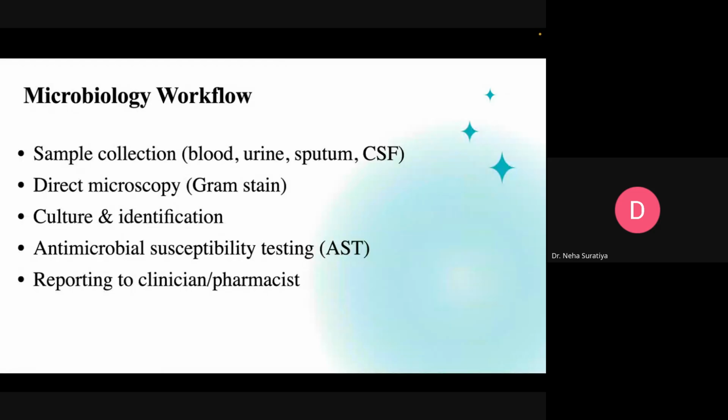So this is not our area of expertise, but yes, how exactly it is happening should be in our head. Okay, so we must understand steps 1 to 4. Main work begins by the fifth step, and we are reading further what exactly the report is all about. But I hope the microbiology workflow is clear to you, from sample collection to making a report.